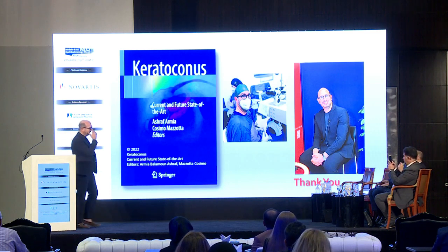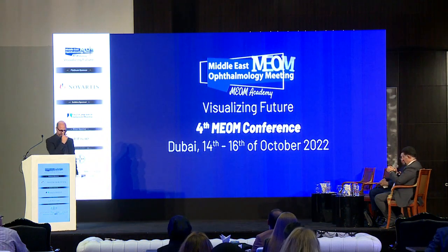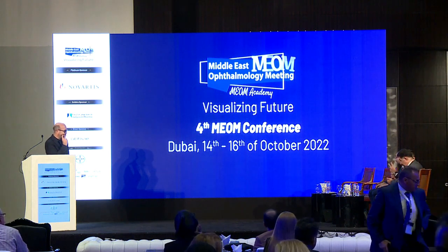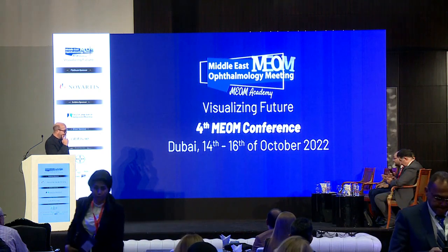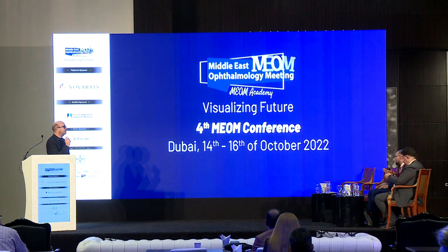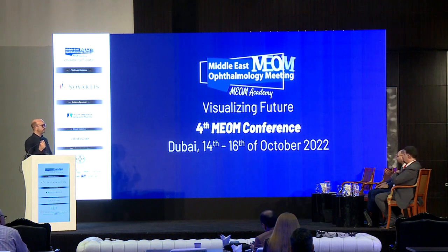Great, thanks, Cosimo. So to summarize, the use of the laser and the cross-linking is still debatable whether it's simultaneous or sequential, but there are 2 important facts raised with the advancements of the technology for the tomography: that the total corneal power reduces all the consumptions of the tissue that we were using to treat the anterior instead of the total corneal power, and the use of the mitomycin C was not a correct use because it was one of the causes of the haze or increased the haze, because one of the important issues is the hyperopic shift and the haze of the cornea.